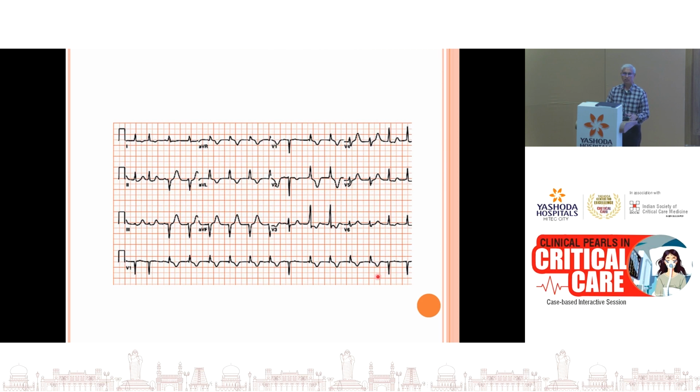This kind of a pattern is very typical of what we call an accelerated idioventricular rhythm. This typically occurs in the setting of an acute myocardial infarction, especially after giving reperfusion therapy, giving thrombolytic therapy, or during a primary PCI. And this is a frequent rhythm. This doesn't often require any intervention.